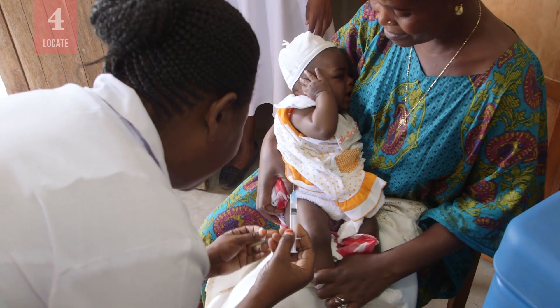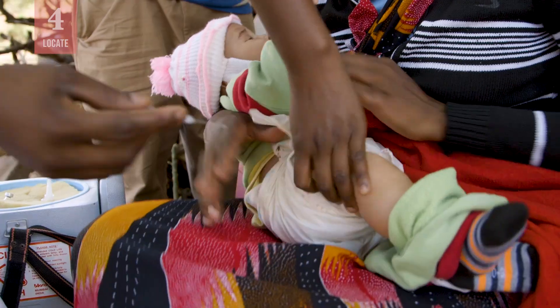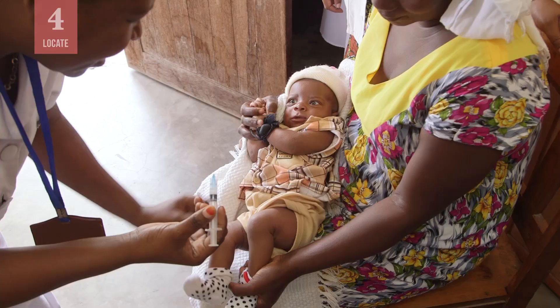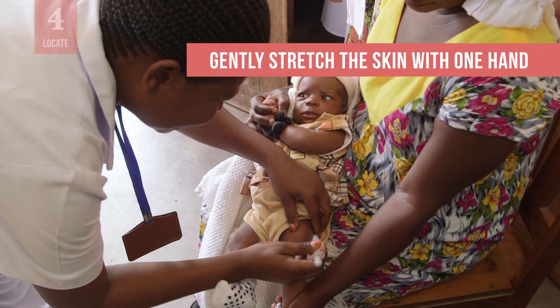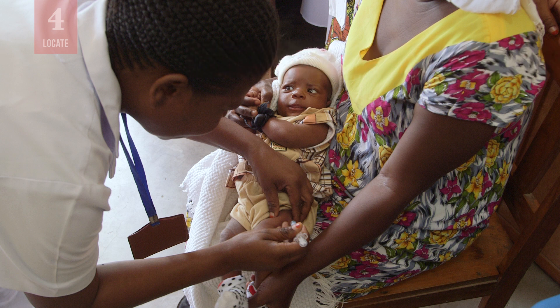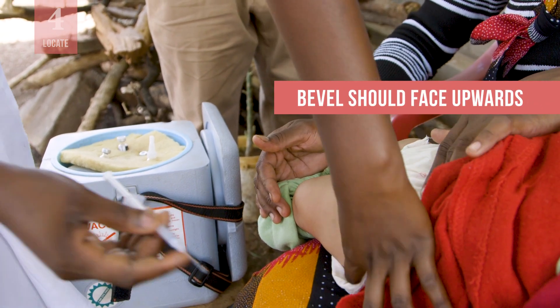If the skin looks dirty, wash it with water, not alcohol. Swabbing clean skin is not necessary. Gently stretch and support the skin between the thumb and forefinger with one hand. With the other hand, hold the syringe barrel with fingers and thumb on the sides of the barrel. The bevel or hole of the needle should be facing upwards.